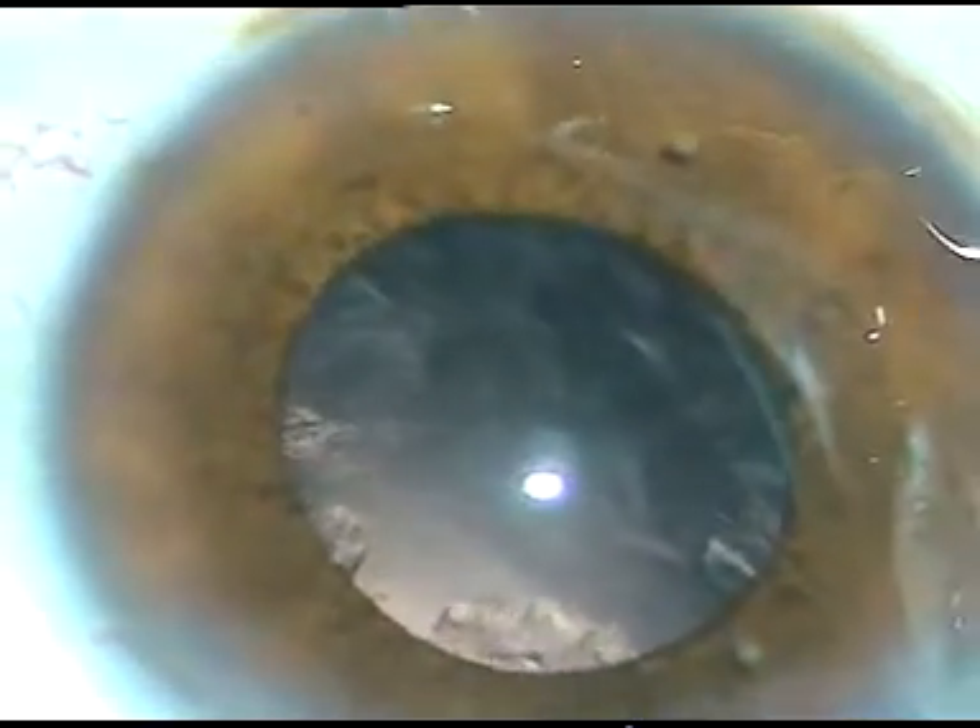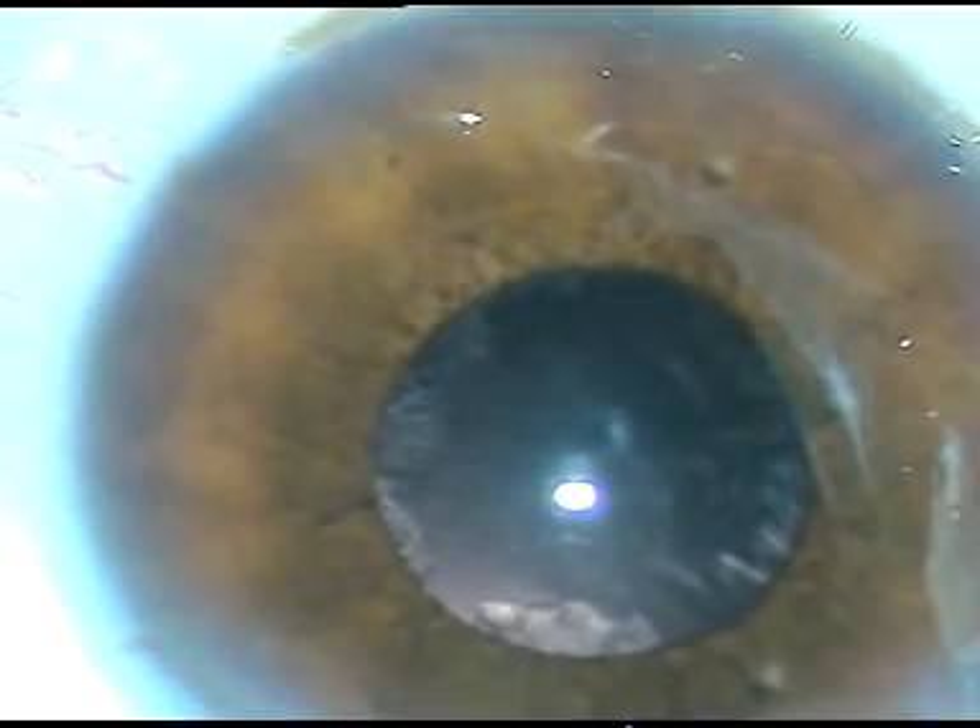I have planned to emulsify these fragments without using the side port. So I go into the eye, enter the anterior chamber, and start emulsifying the nuclear fragments with only one hand. I am not taking the help of the chopper in this case, and see — the pupil is remaining quite dilated. This is the tip I am going to share: if you anticipate that the pupil will become small while emulsifying, just chop the nucleus into fragments and do one-handed phaco like this. As soon as the IOP gets less, the pupil becomes small.